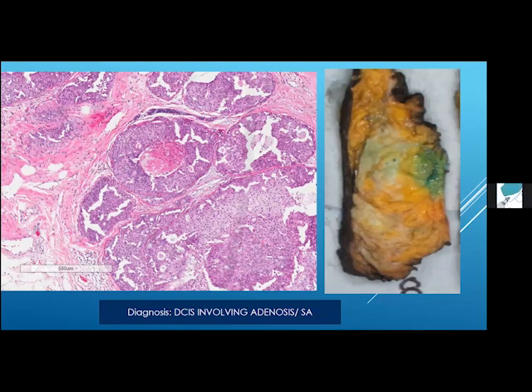I would ask the presenter, if you would order your myoepithelial markers and you would see that, let's say, 1 or 2 or maybe 3 ducts or tubules actually did not show myoepithelial cells surrounding a very well-defined circular acinus, would you call it invasive carcinoma?